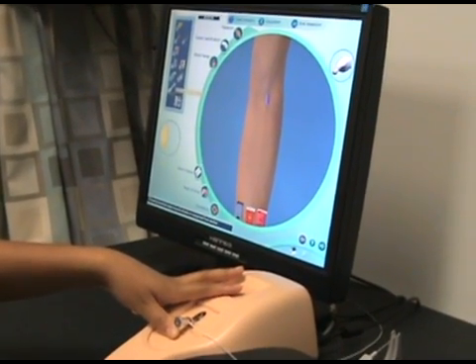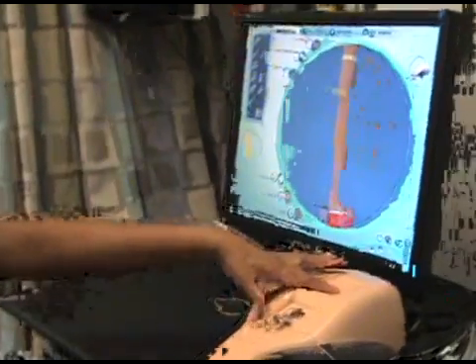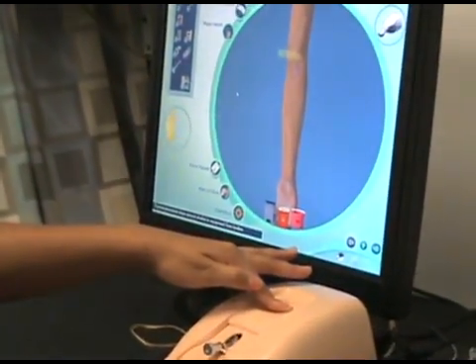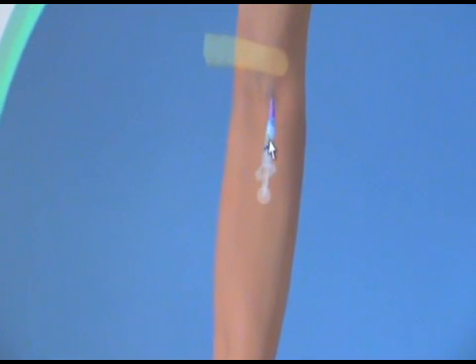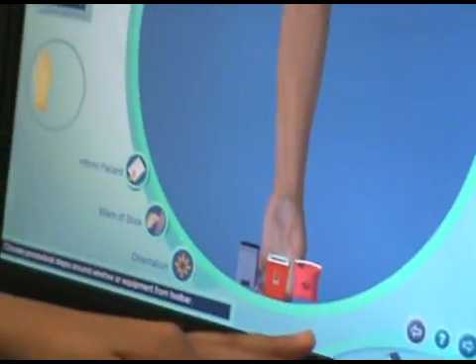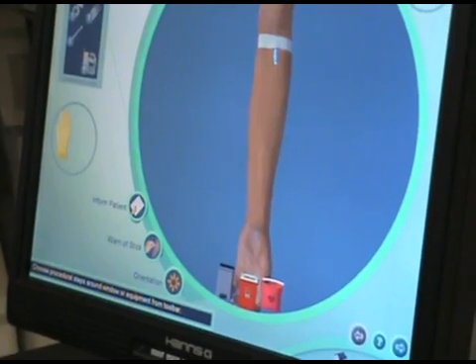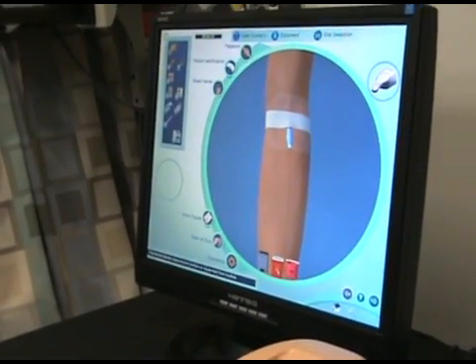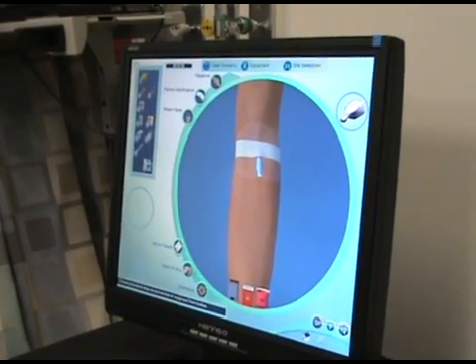You take out your tourniquet. You press this to hold the blood from going back, take out the tourniquet, and throw it away. Then you get your lock and flush — you lock it and then flush it. Throw it away. You can let go, get your tape and tape it down, then put your bio-occlusive dressing. We got the IV — now we're done. So you throw away the gloves in the biohazard and wash your hands again, because you always want to wash your hands after procedures.